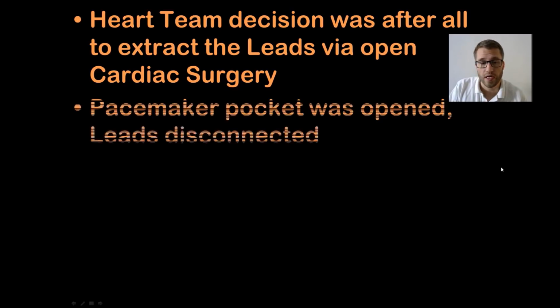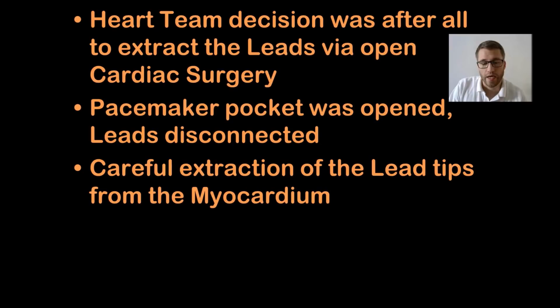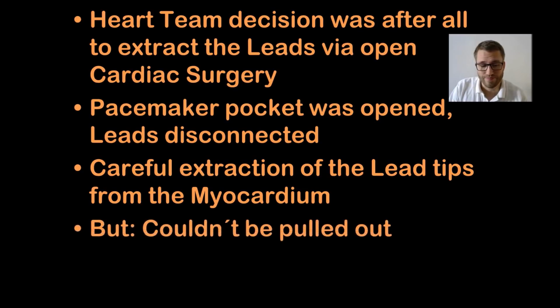So the patient got another thoracotomy, the pacemaker pocket was opened, the leads were disconnected, and the tips were carefully extracted from the myocardium. But they couldn't be pulled out. Somewhere they were attached to the tissue of the vessel, and if you pulled on the leads on the top, they did not come out.